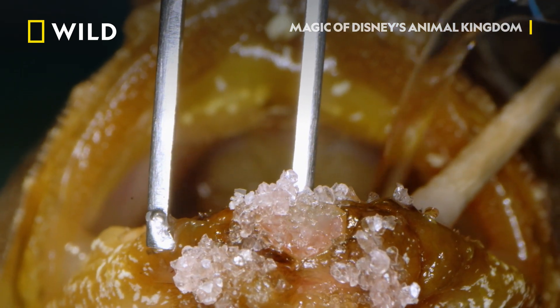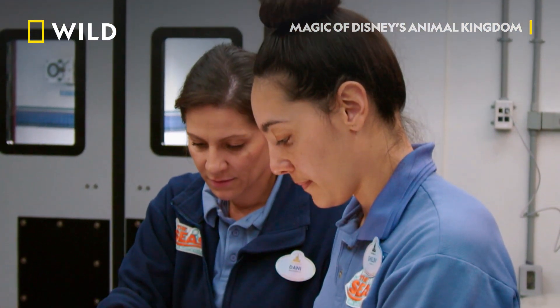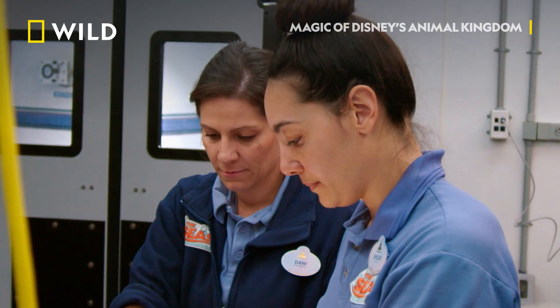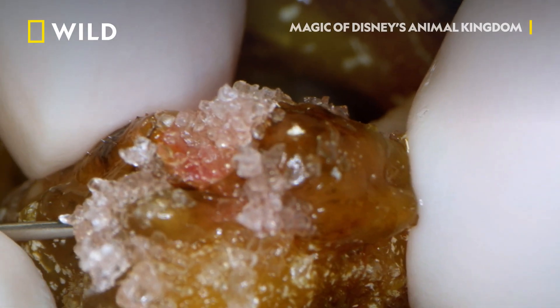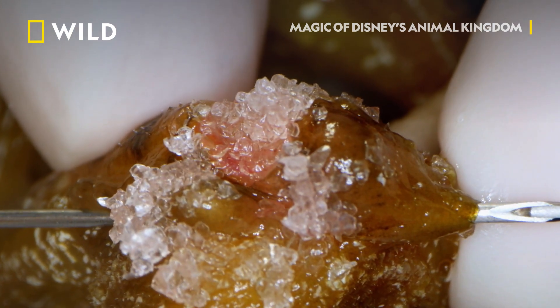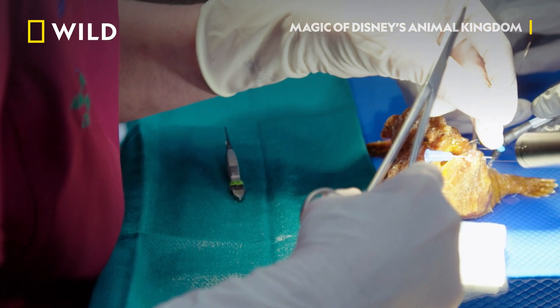But his badly broken jaw still needs support. Can I have an 18-gauge needle, please, sterile? I'm going to place the needle in between both pieces of bone, and it's actually going to create a stabilizing force. And that's going to allow everything to heal nicely.